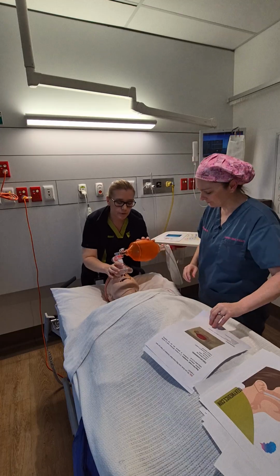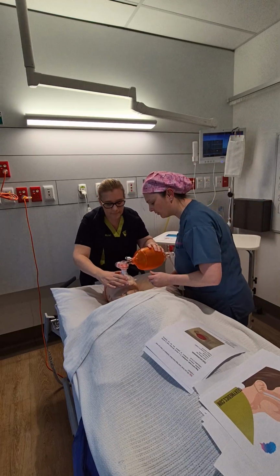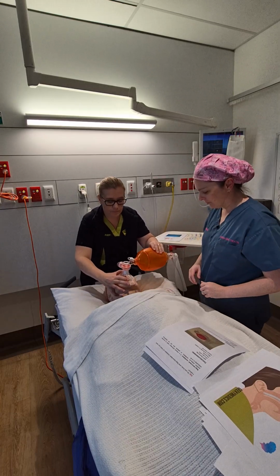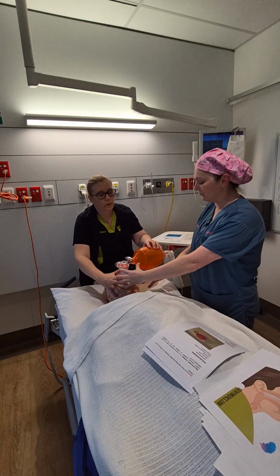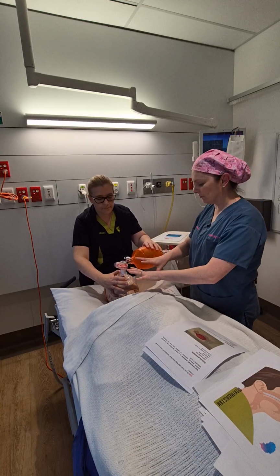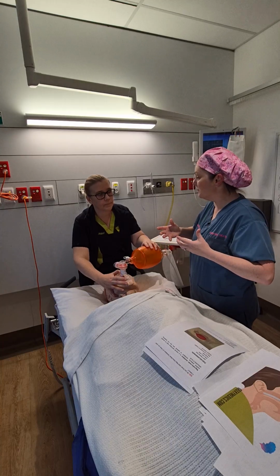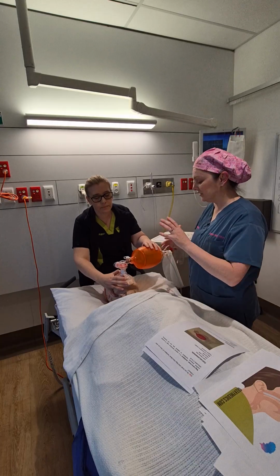Okay, so I want to go over a good seal, so down the bottom, over the top of the nose. Wonderful. Do your little jaw support with your fingers there. Wonderful. So if you've got a smaller man, it's quite easy. You and me both have small hands. I really struggle with people that are bigger. So if you can't do one-hand ventilation, it's fine. Just get someone to help you.